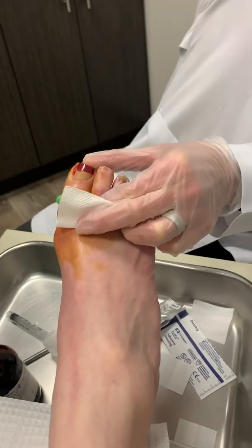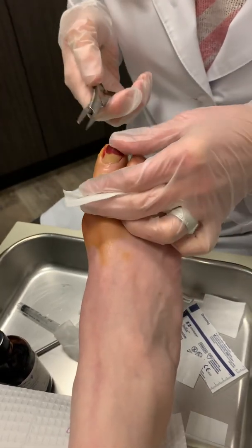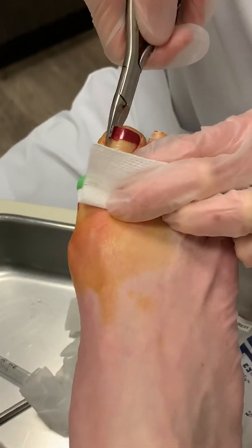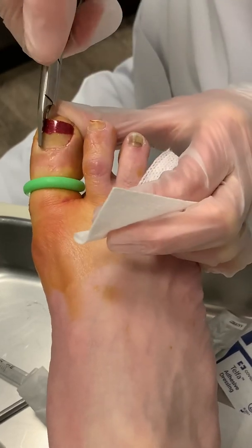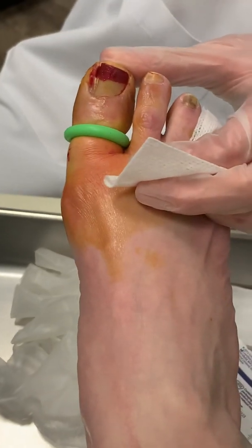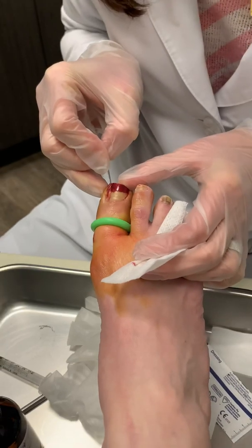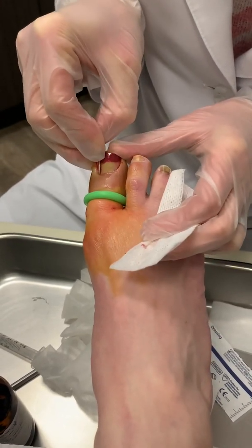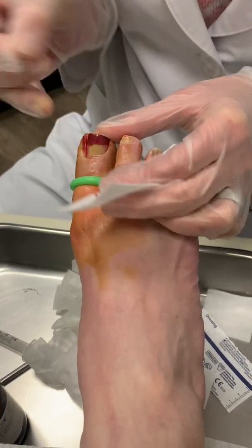The next step is you use an instrument called an English anvil, and you put that instrument right down the nail edge, and then you basically cut the nail. Then you use a different shaped type of scalpel tip, and that goes right down that same edge and goes underneath the skin fold to release any of the nail that we can't see with the visible eye.